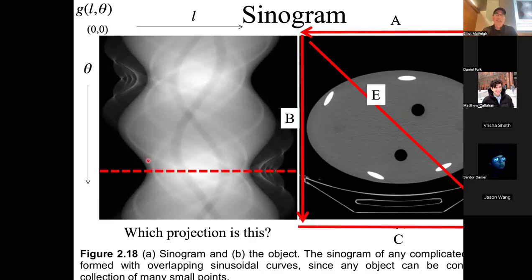So if I look at this and ask when the projection of this big part of the object narrows down the most, it would be whenever it's the thinnest, which would be in this direction, as we're projecting down in this direction. Now there's one last thing to figure out.